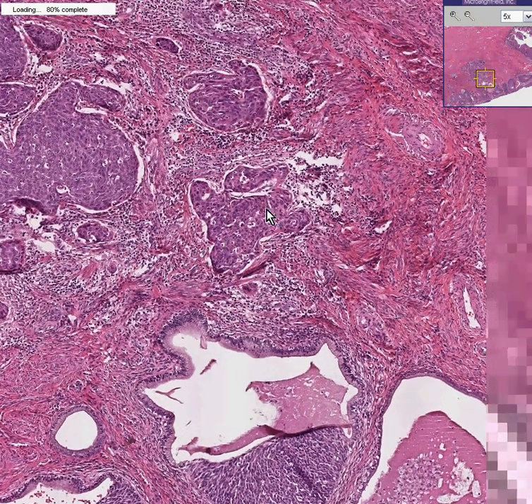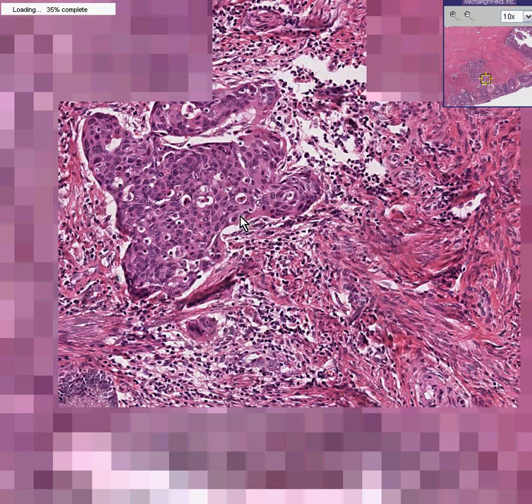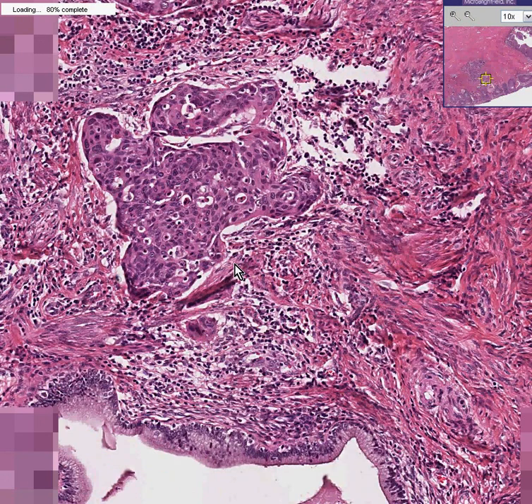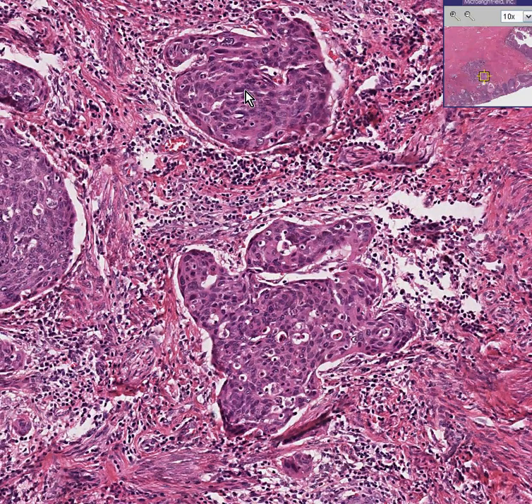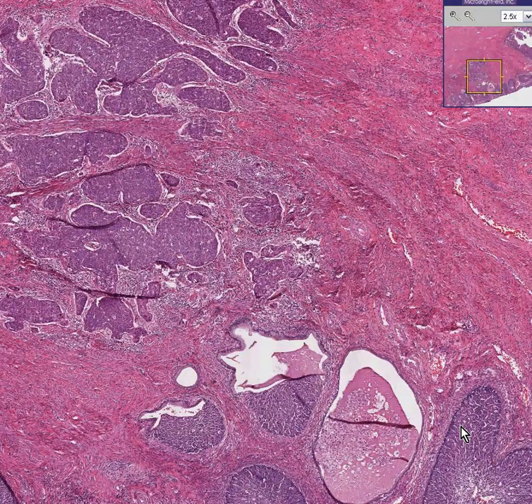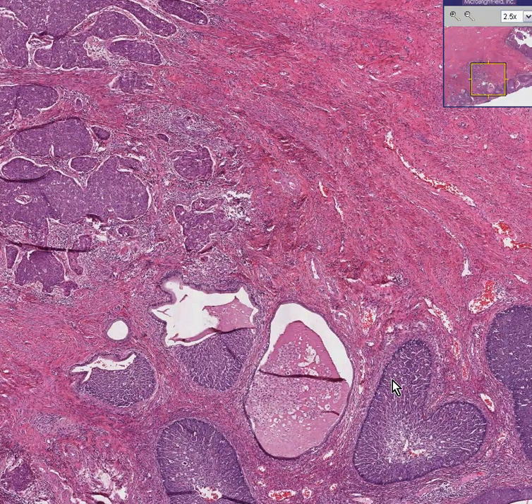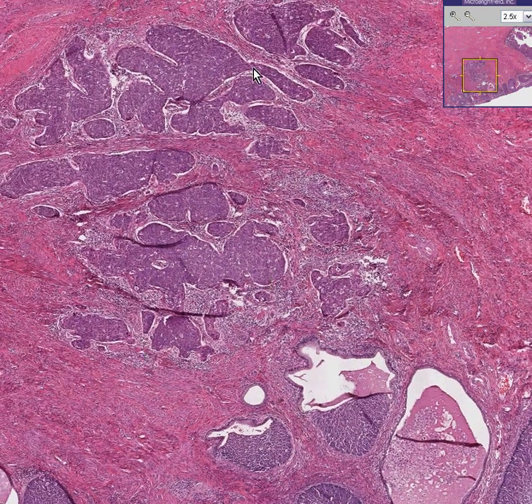On the other hand, this structure here has absolutely no semblance of a gland at all. It's very irregular — it goes out into the stroma. This is infiltrating squamous cell carcinoma, as compared to squamous cell carcinoma in situ here, which has still not infiltrated other than the fact that it's involving a gland. But all of this stuff out here has infiltrated.